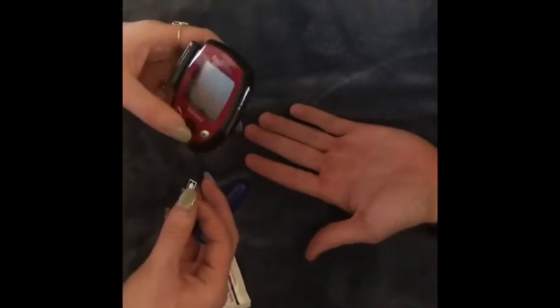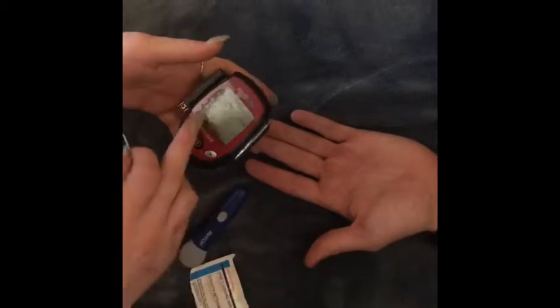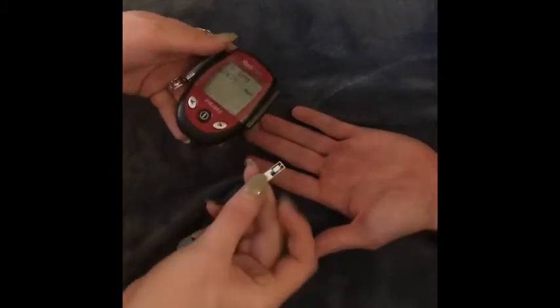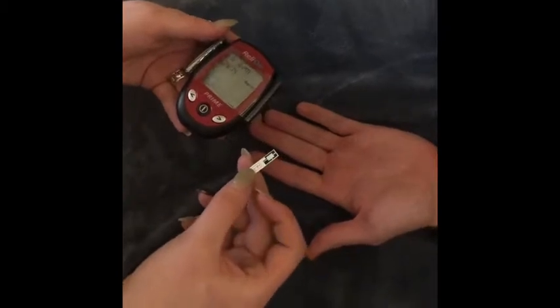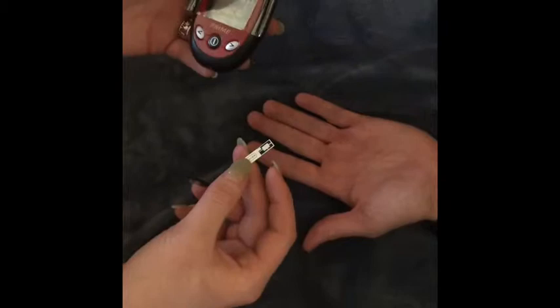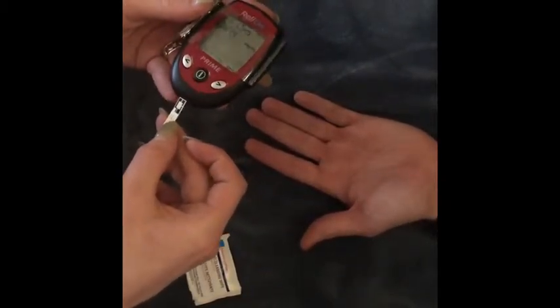First, we'll turn the machine on — all you do is press the button. It's already set for the time and date. Then we put the end that has the strip of boxes into the bottom of the machine.